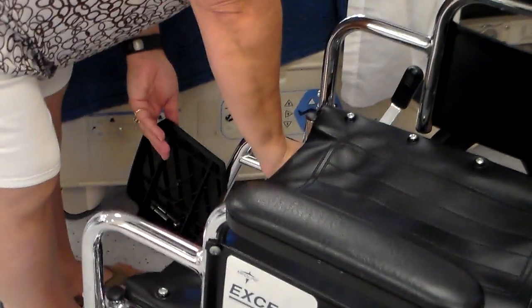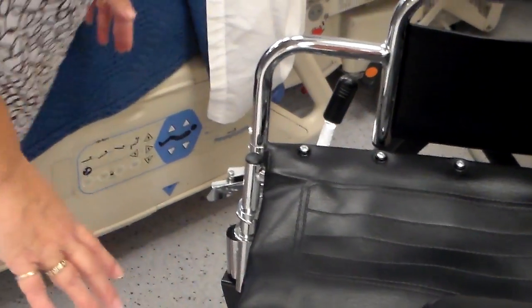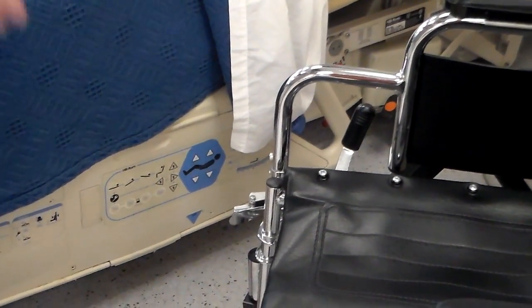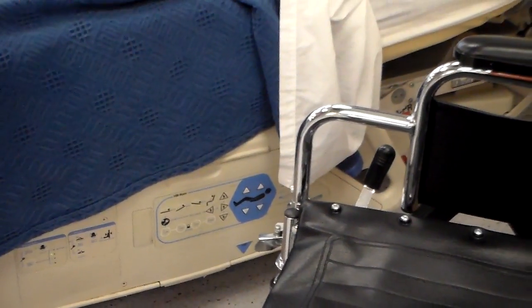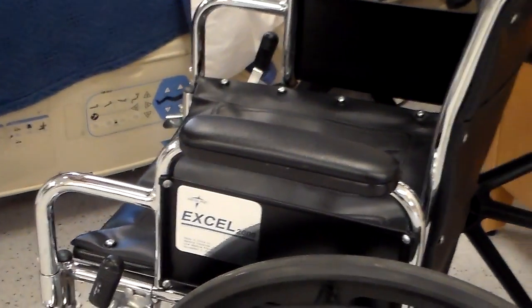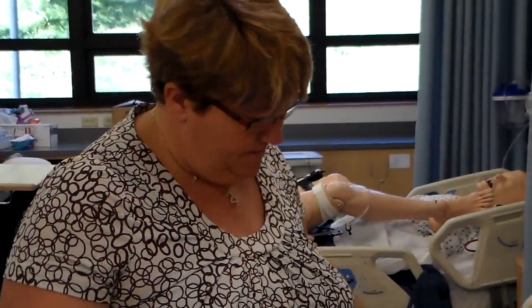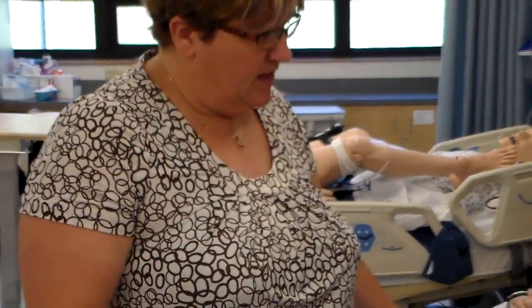So you want to make sure the legs are out of the way. Why do we want to make sure they are out of the way? That's right. It's less that we have to worry about tripping over, banging our shins or our ankles on, less skin tears between either ourselves or the patient, because good Lord knows we don't need any more paperwork, right? Okay. So then we get those out of the way.